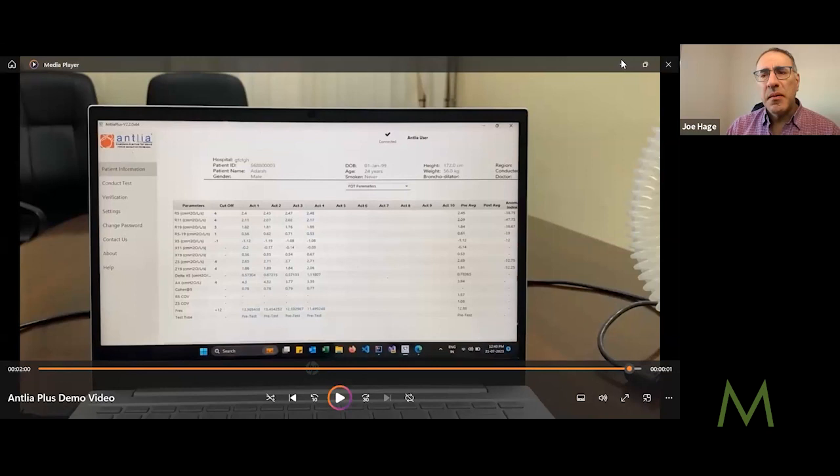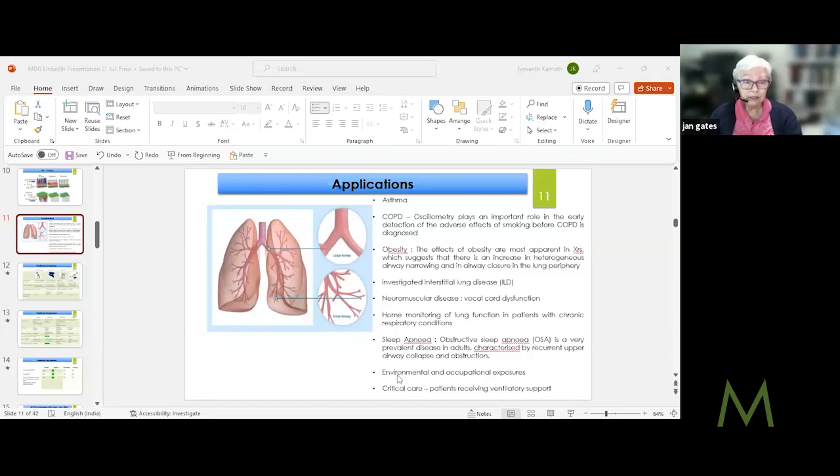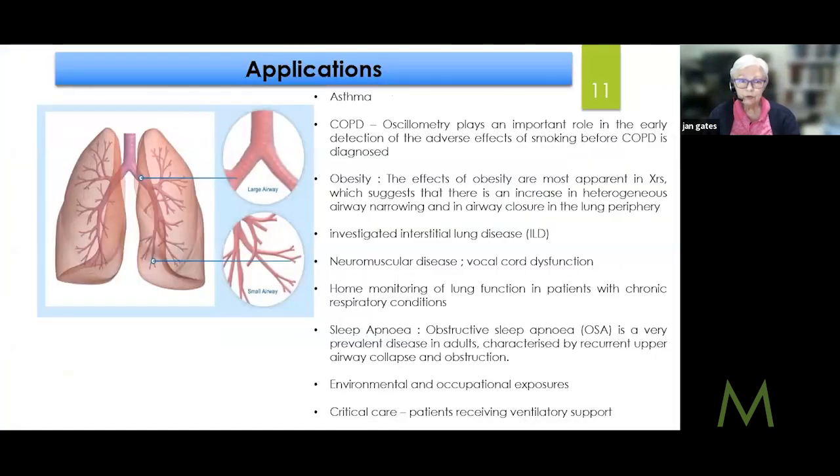I'm looking at this and it seems like you would have to have a before and after, making sure you understand the obstruction or not that's going on in somebody's lungs. If I look at a practical use, my sister had lung cancer and they used a spirometer to find out what her lung volume was. So when they took a lobe out of her lung, they knew what was going to happen and if she could survive that, and then how to exercise her lungs later with a spirometer. And I don't see how this would be helpful at all.